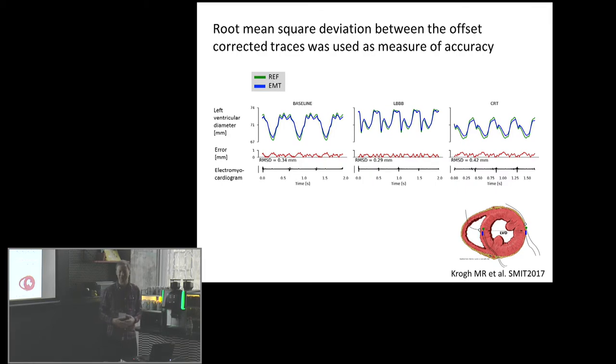So that was interesting. The reason why EMT is always lower, I think, is that to track surgical equipment, a surgeon doesn't move that fast. I'm guessing, I don't know, but it depends on the use. And so in order to use it for this purpose, you need a higher sampling rate. So that was a message, I guess.